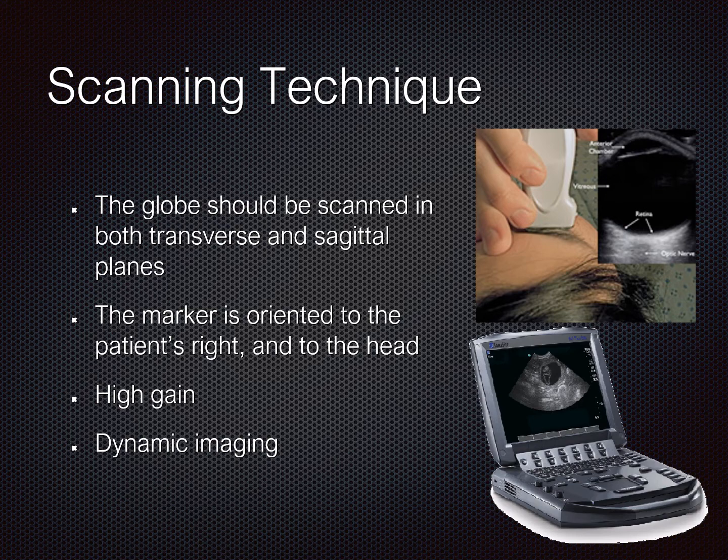Special things about the eye in terms of settings on the machine. Ocular presets on the machine will change the energy output of the machine. So the eye is one of the tissues like the testicles, ovaries, and babies where we want as little energy in the scan as possible because these are sensitive tissues.